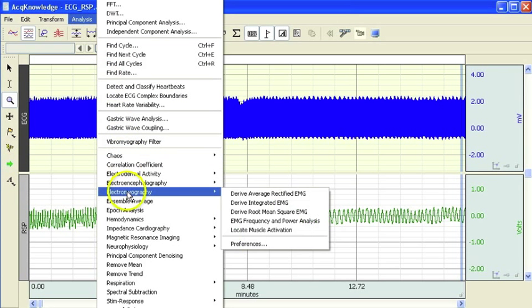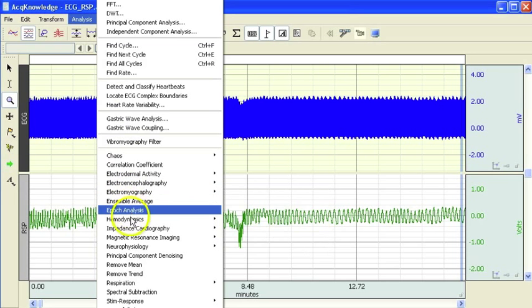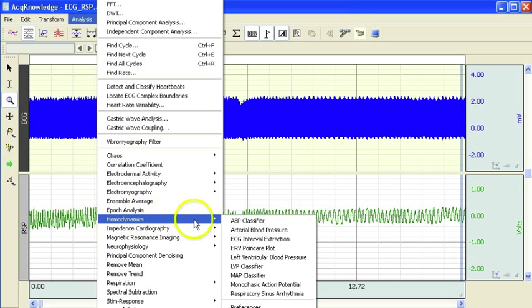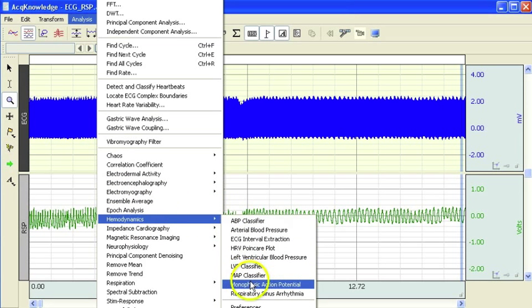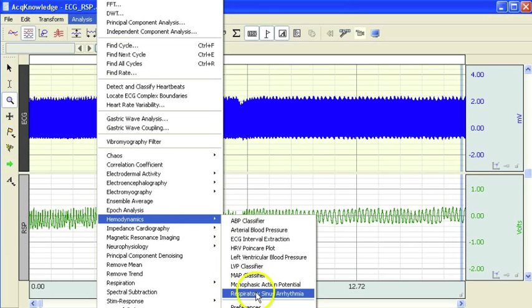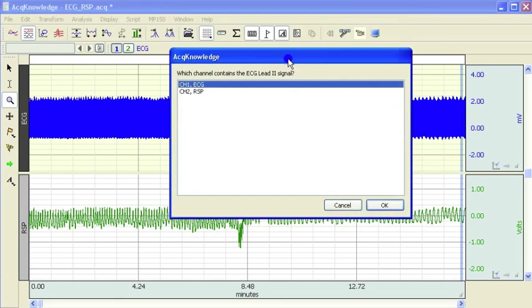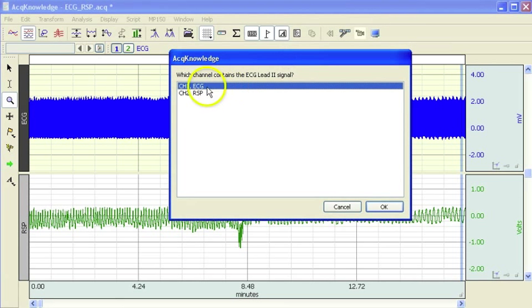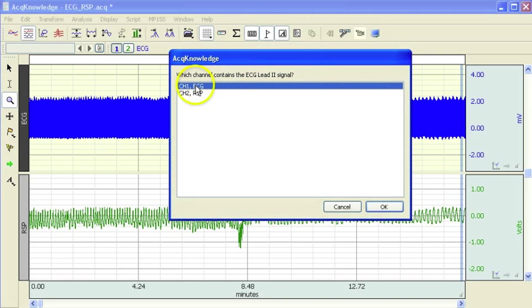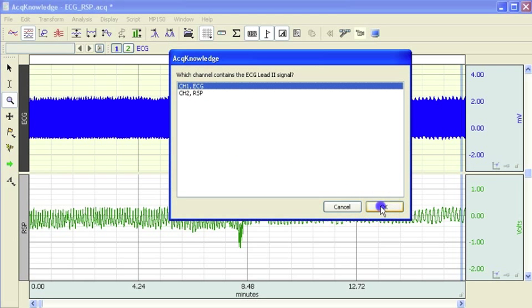This particular analysis is found in the hemodynamics menu and it is labelled respiratory sinus arrhythmia. The software asks you or prompts you for the ECG channel, in this case it is channel 1.